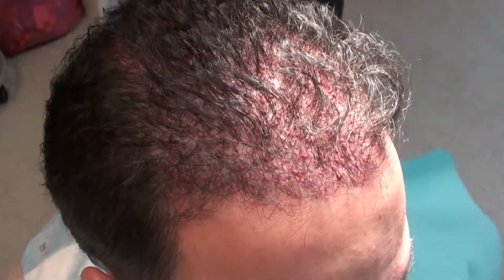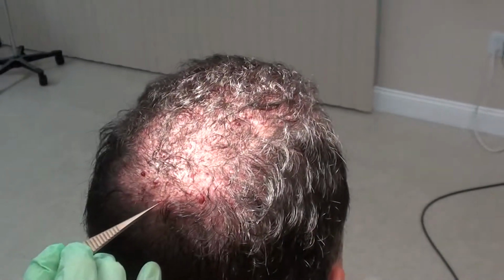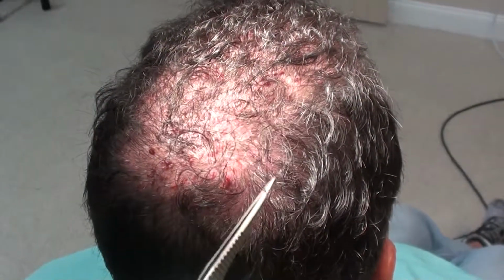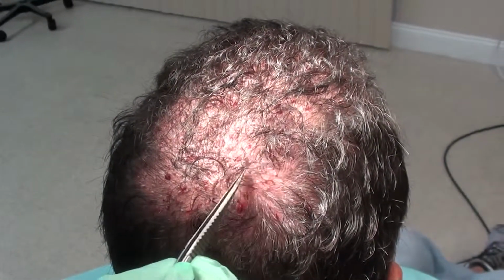And then we went in the crown, and we restored into the crown, built a spiral all the way around. So these grafts came in at an angle that were going like this. These are going this way. These are going this way. You got it built all the way in and through the existing hairs all the way around. So you can see those little grafts in there. Those are all little grafts that we put in there.